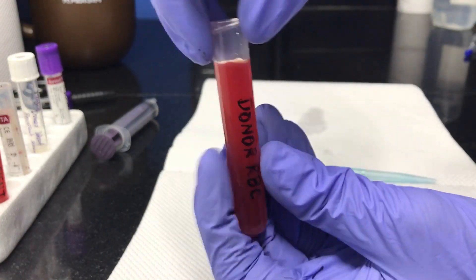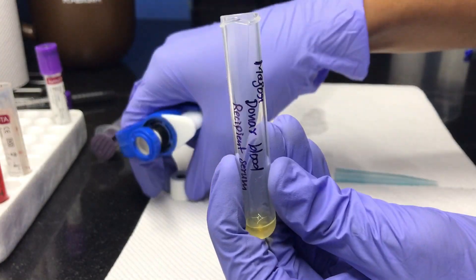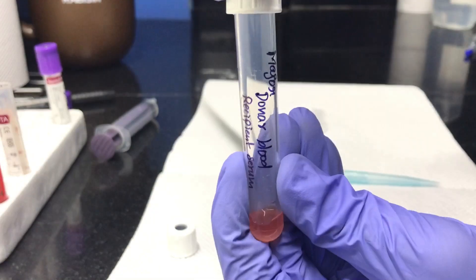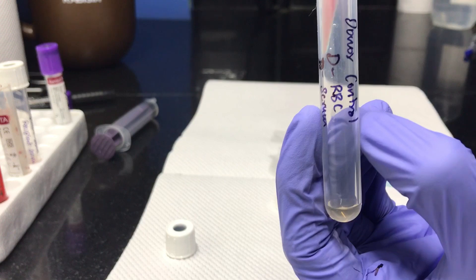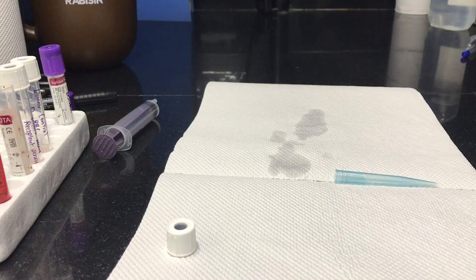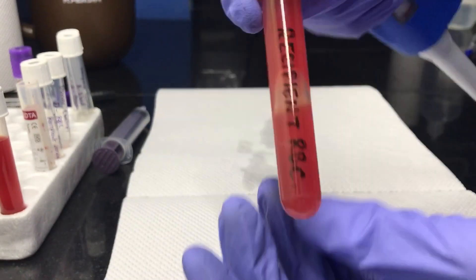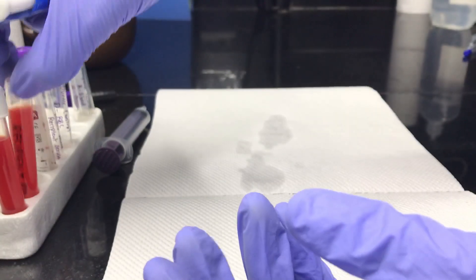Take donor RBC, pipette out 200 microlitres, and add it to the major test tube. Add the same amount to the donor control. Similarly, pipette out 200 microlitres of recipient blood and transfer it into the minor test tube and recipient control tubes.